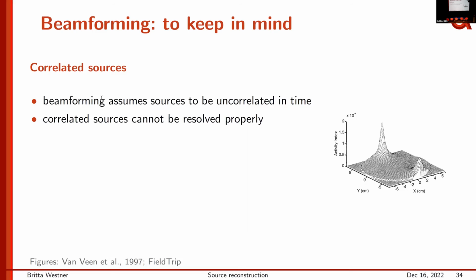My question was very linked to that. Could one not just orient the dipoles in the orientation of the cortical sheet because it's folding, instead of modeling the boundaries? Yes, so I talked about vector and scalar beamformers, and I said that often you would orient your source in an optimal way given the data. Another way to get a scalar beamformer is by using a fixed orientation, and that is exactly what you say, that you fix it relative to the brain surface.